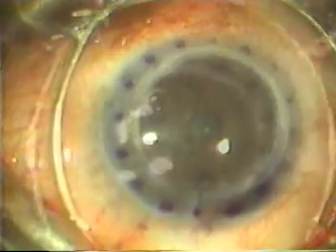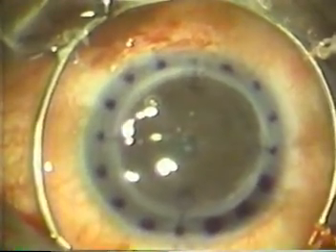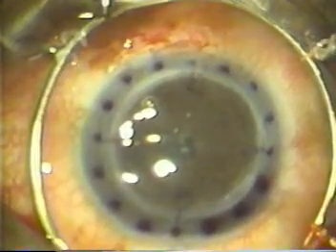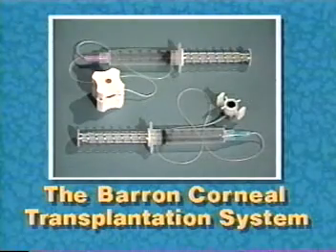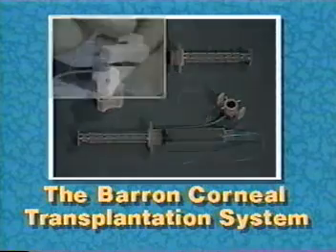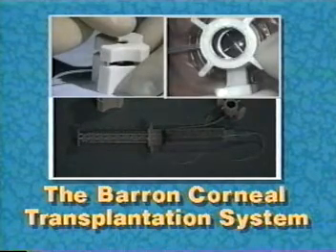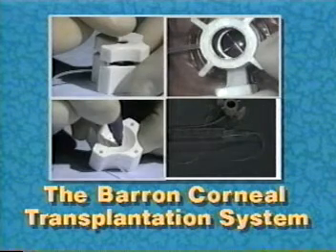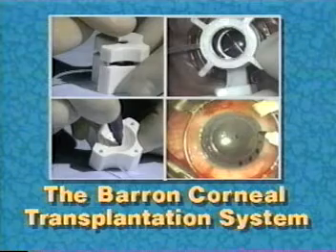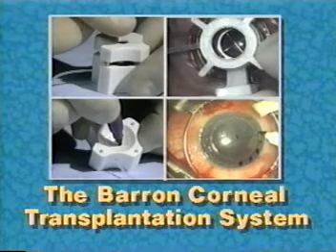No guesswork. The third and fourth sutures are placed in a similar manner. The remaining radial marks on the recipient cornea can be used for additional suture placement. The Barron transplantation system is the only system that stabilizes both the donor and recipient corneas as they are cut, contains crosshairs for centration, and marks the donor and recipient corneas for even tissue distribution and suture placement. Steps toward achieving a perfect transplant.